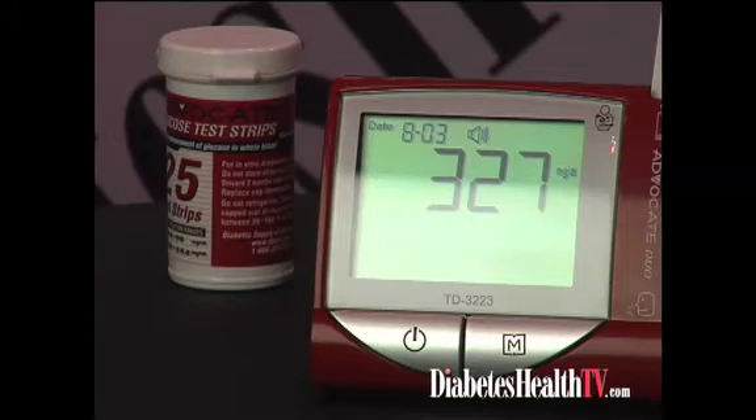The blood glucose is 327 milligrams per deciliter. It's pretty high. Right — it's within range for the high control. You have high control solution and low control solution to test your test strip. And that's it. To turn it off, remove your strip, discard the strip, and it turns off. And we're all set.